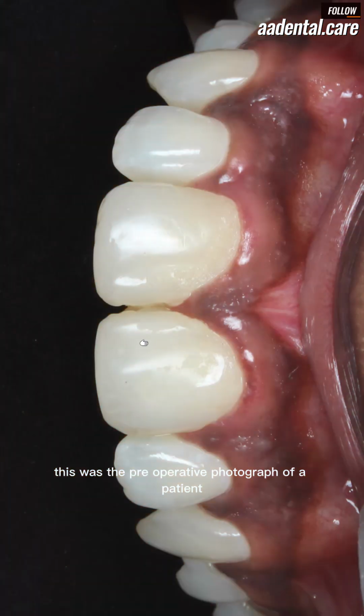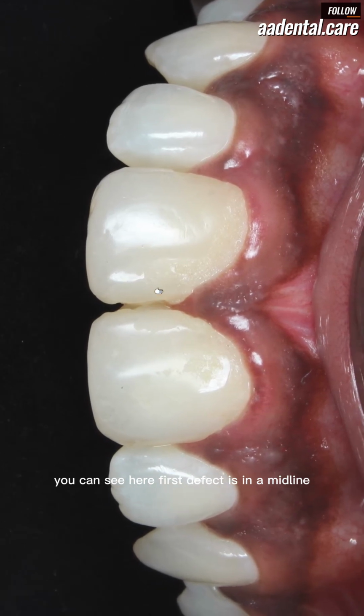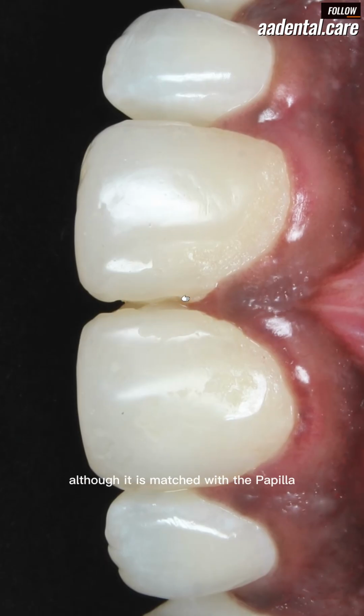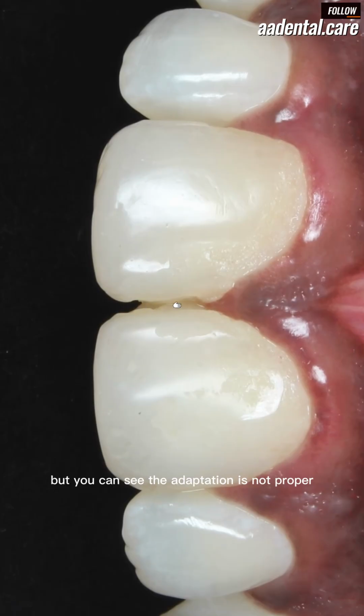This was the pre-operative photograph of a patient. You can see here, the first defect is in the midline. You can see the midline is so improper. Although it is matched with the papilla, you can see the adaptation is not proper. You can clearly say that a band was not used in this case. The composite was added very roughly.